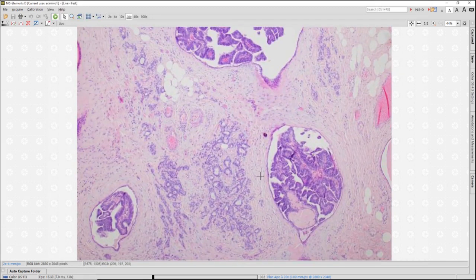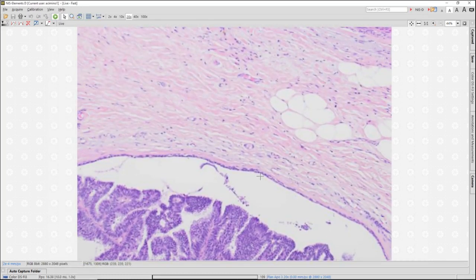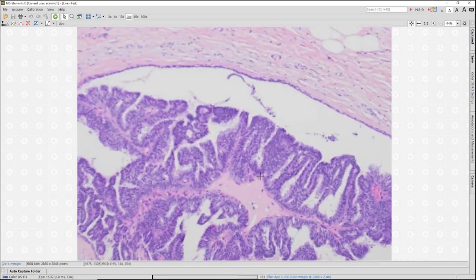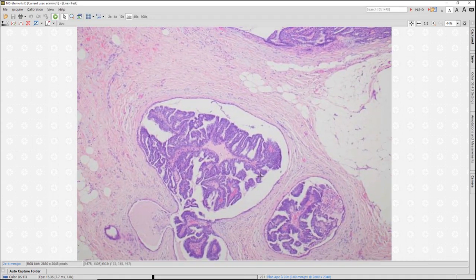Now, I want to end the discussion with 2 lesions that we don't want to misclassify as encapsulated papillary carcinoma. Encapsulated papillary carcinoma is occurring in the duct space, has low nuclear grade, typically nuclear grade 1, maybe nuclear grade 2, strong and diffusely ER positive. We're staging them as in situ. So we want to be pretty sure that this is encapsulated papillary carcinoma by the books, by the definition.